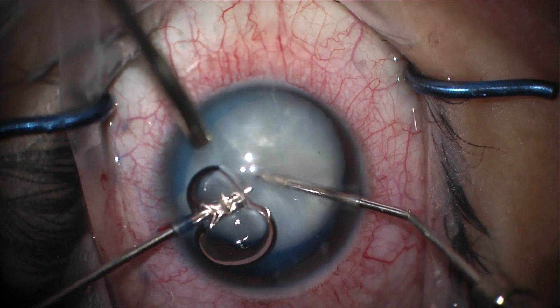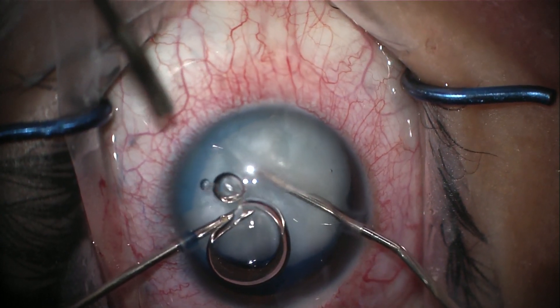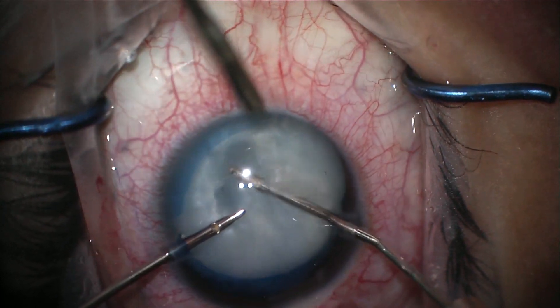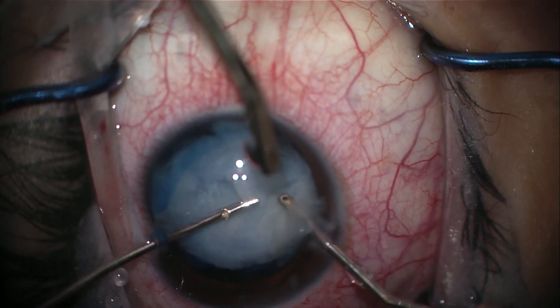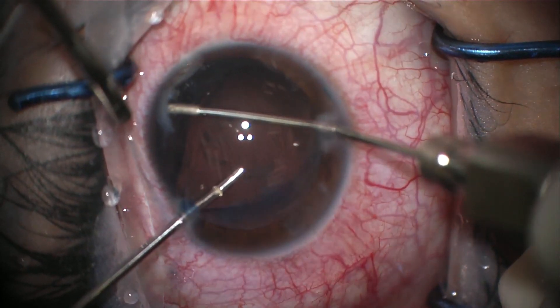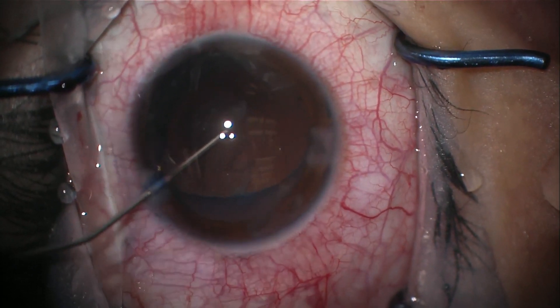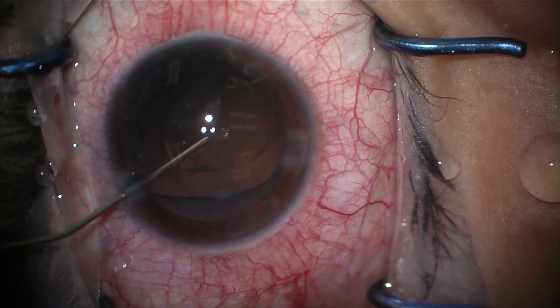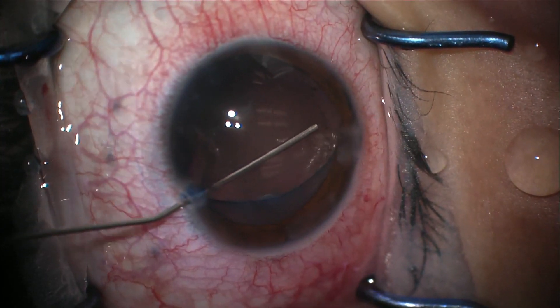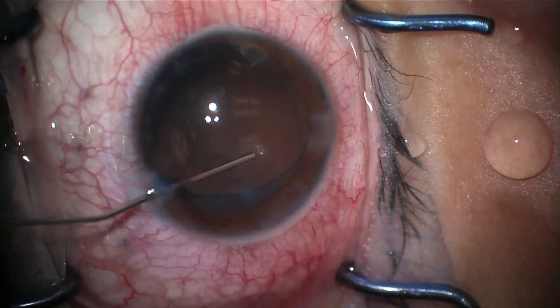Using a bimanual handpiece, the surgeon only needed to use aspiration to remove the milky lens, likely because the patient was young and the cataract was not very dense. Using a cohesive OVD, the capsule integrity is tested. Thankfully, the tear did not continue posteriorly, meaning the capsule can still be used to hold an IOL.